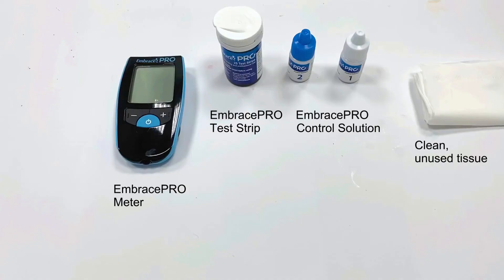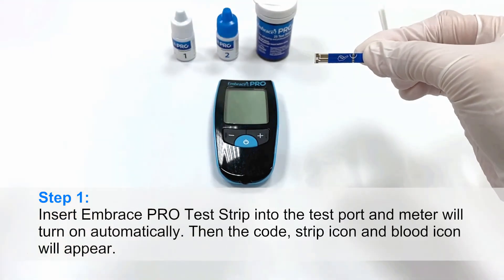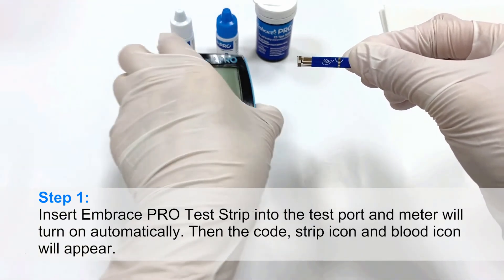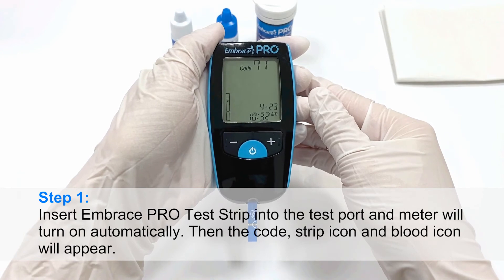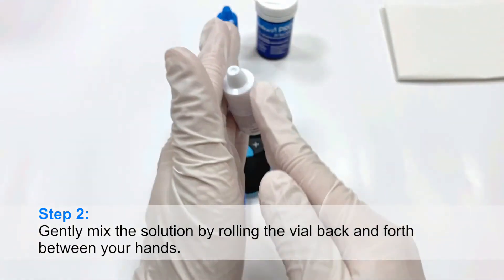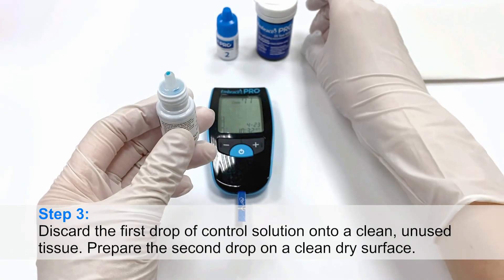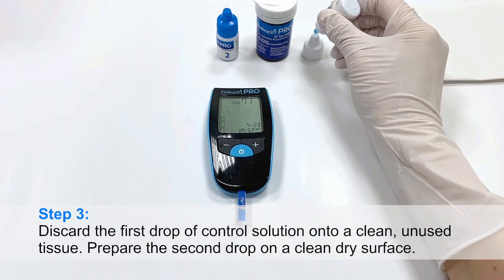Performing a control solution test. Step 1: Insert EmbracePro test strip into the test port and the meter will turn on automatically. Then the code, strip icon, and blood icon will appear. Step 2: Gently mix the solution by rolling the vial back and forth between your hands. Step 3: Discard the first drop of control solution onto a clean unused tissue. Prepare the second drop on a clean dry surface.